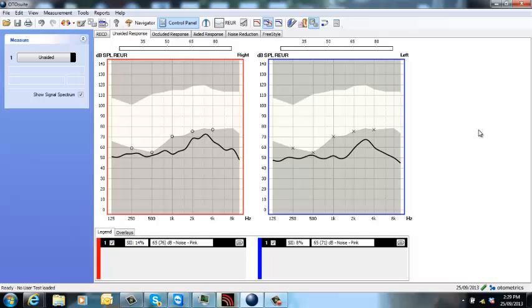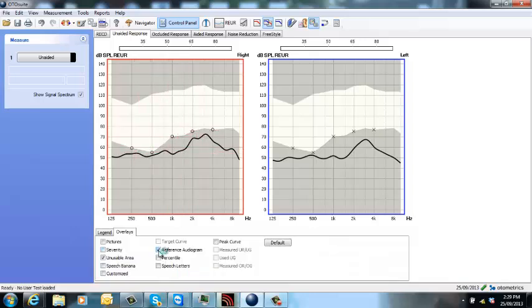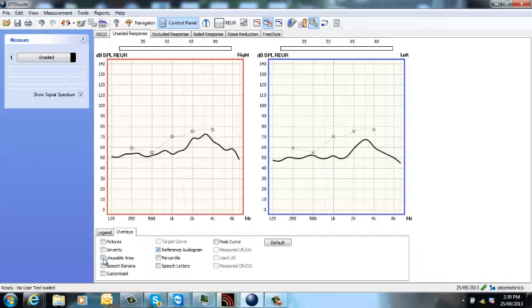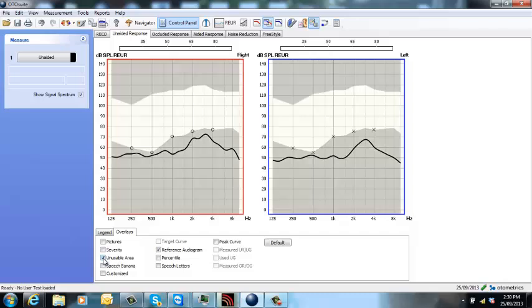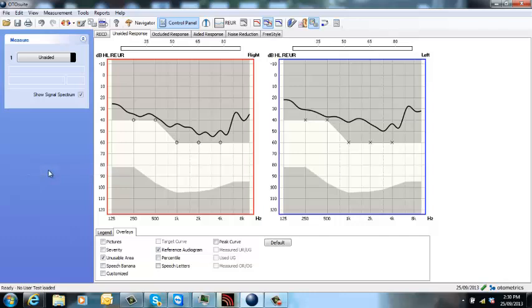Now let's just have a little talk about the view here before we move on. At the moment you can see the thresholds for the audiogram. If I tick that off, that disappears, and also unusable area—if you don't like that, you can tick that off as well. You can view response in both SPL or HL, whatever you prefer. I prefer SPL.